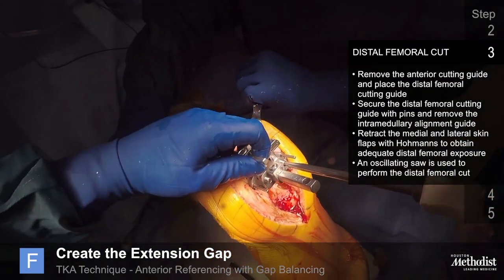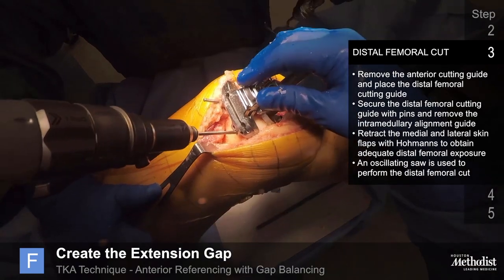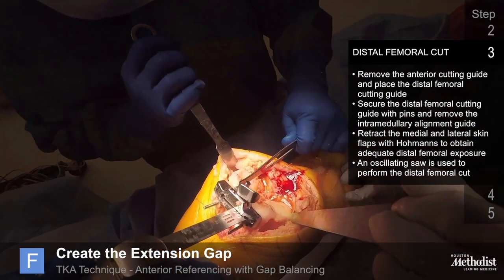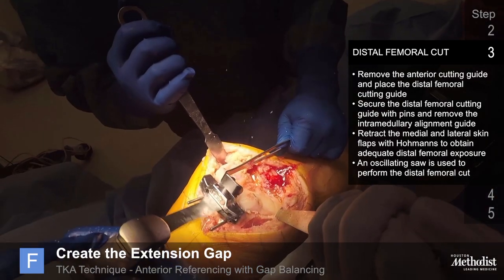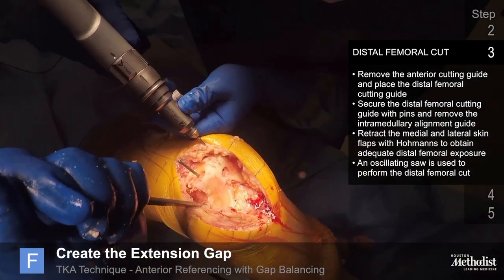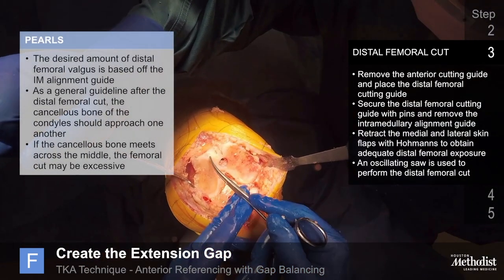Remove the anterior cutting guide and place the distal femoral cutting guide. Secure it with pins and remove the intramedullary alignment guide. Retract medial and lateral skin flaps with retractors to obtain adequate distal femoral exposure, then use an oscillating saw to perform the distal femoral cut, ensuring it is complete all the way to the posterior femur. The desired amount of distal femoral valgus alignment is based off the intramedullary alignment guide. As a general guideline, after the distal femoral cut the remaining cancellous bone bed of the condyles should approach one another centrally; if the cancellous bone meets across the middle, the femoral cut may be excessive.